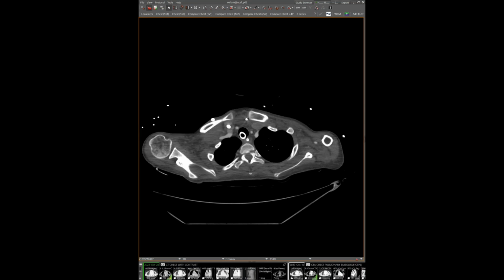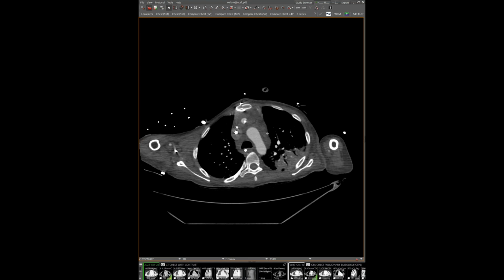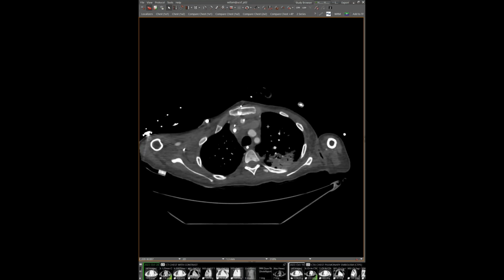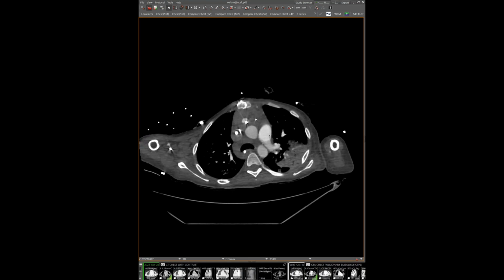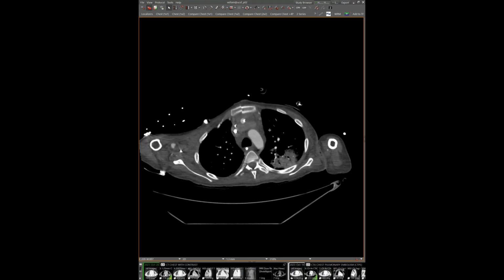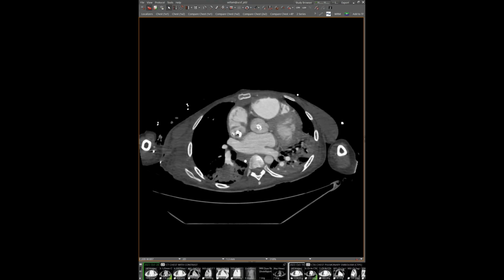So I've seen a case like that where we puzzled over what looked like a tubular opacity, and it turned out to be the not completely removed synthetic graft, through which they had placed the Impella device. So that's just a gotcha potentially down the line. Cool. Nice.